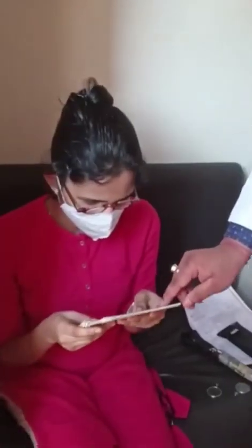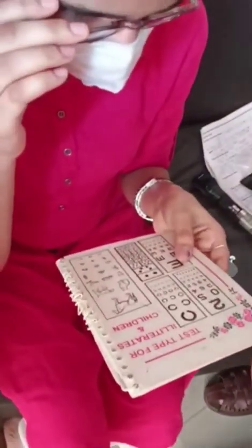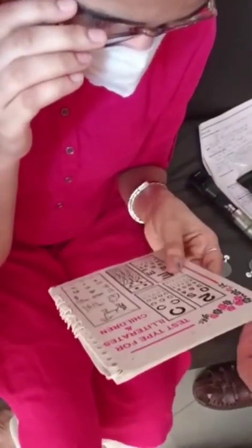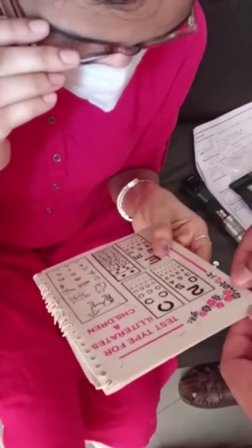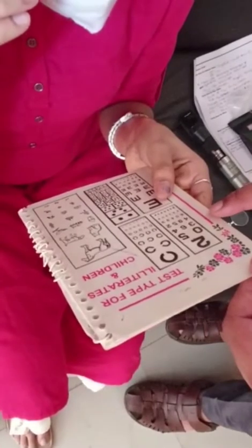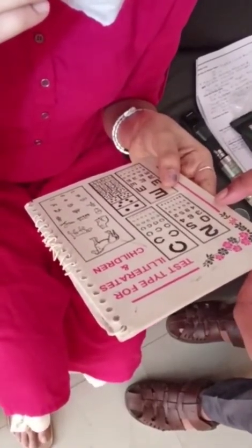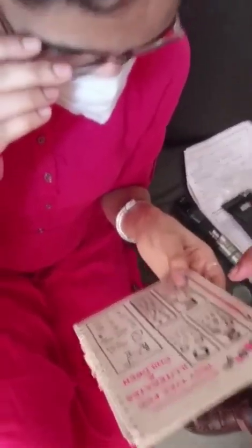Can you read this? 205364. 4952. 60493. Okay. 593206. Okay. 0469536. Okay.